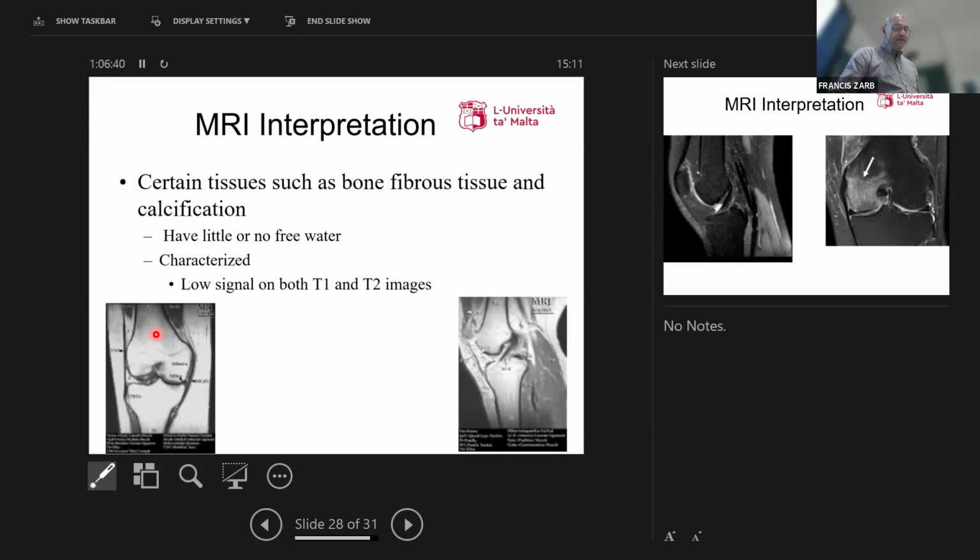It's the bone marrow. Yes. The signal there is not the bone. It's the bone marrow within the bone, which is fat. That is a T1 weighted sequence, therefore it's giving a bright signal. If you look at the cortex, that black line, that's cortical bone. It's not giving a signal, because it has no bone marrow.